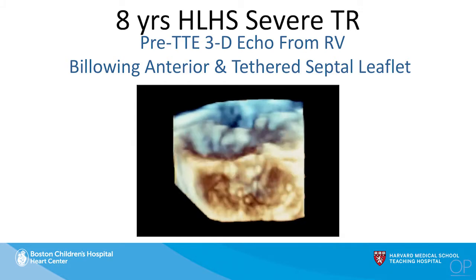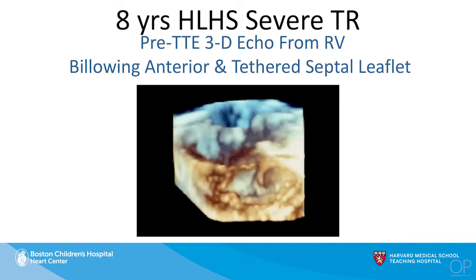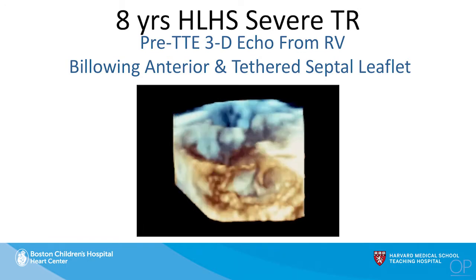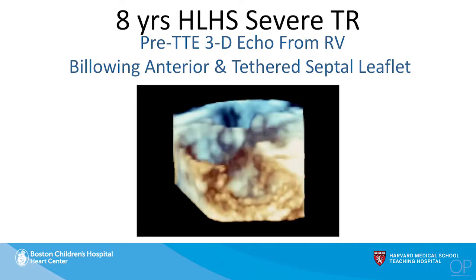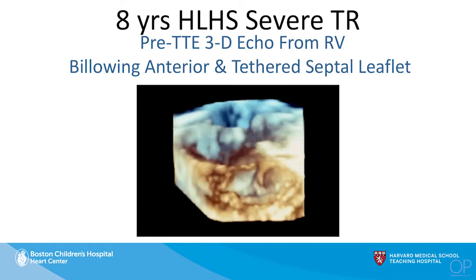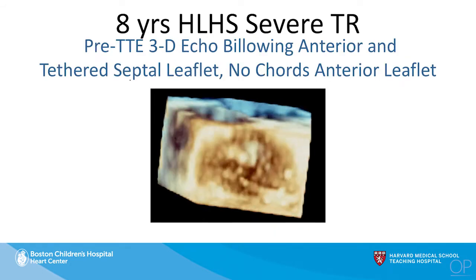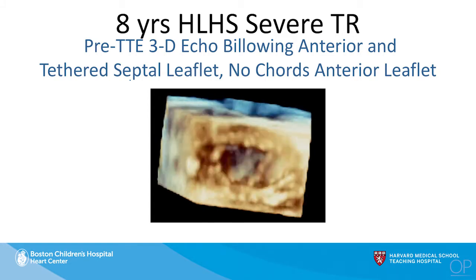Because it's a three-dimensional data set, if we rotate the plane and look at the RV from the apex up towards the under-leaflet of the valve, you can see a portion of it clearly protruding up into the right atrium, almost billowing up there. You can see a significant zone of non-coaptation between the anterior and the septal leaflet. We started to get the impression that the septal leaflet was severely tethered. Here in the cross-sectional image of the valve from below, you can see a very significant zone of non-coaptation between the anterior and the septal leaflet.